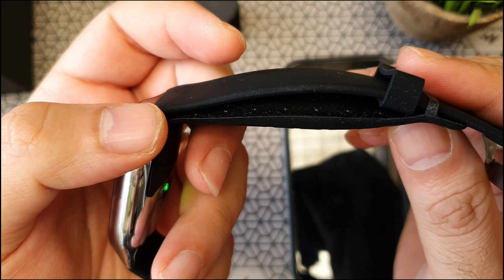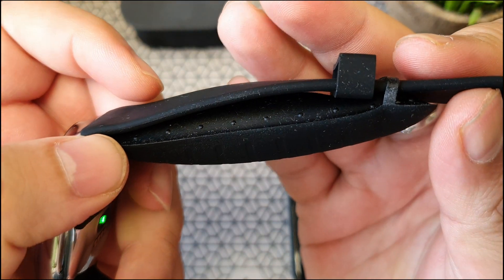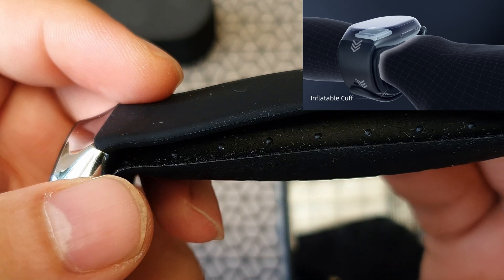Welcome back to Artec. In today's video, we're going to review this smartwatch from YHE Technologies. I've seen so many smartwatches, but none of them had an inflatable cuff. This one's got an air pump inside. Let's review this.